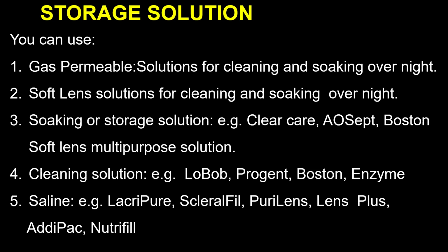So don't just think that it's only in scleral contact lenses. Even in your rigid gas permeable contact lenses and all other forms of contact lenses, if it is very, very needed, you can fit it using segment modification. Thank you, sir. Thank you, Dr. Osazee. That's a good addition. So the truth is that scleral contact lenses are custom made. You can achieve a lot of designs. You can play around with the design and achieve a lot with it. So you can tweak the curvature to achieve the fitting you want. It's a good point you added.